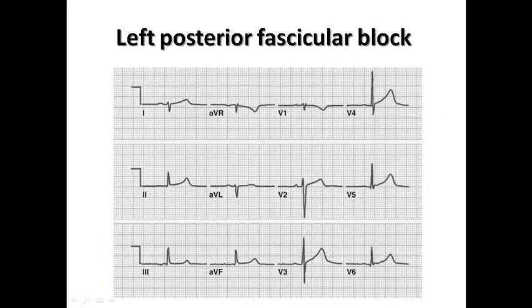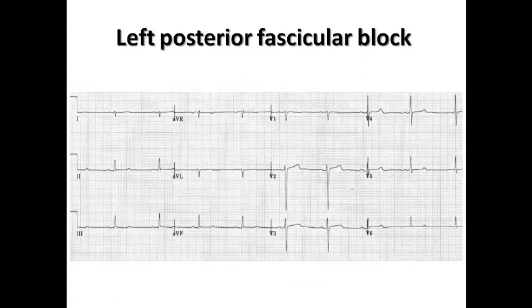Here is an example of left posterior fascicular block. Predominantly positive complexes in leads II, III, and AVF with predominantly negative complexes in leads I and AVL — right axis deviation. There is no right bundle branch block here; it is isolated right axis deviation caused by left posterior fascicular block. In another example, we can similarly find predominantly positive complexes in II, III, and AVF and predominantly negative in I and AVL, with slight prolongation of complex duration.